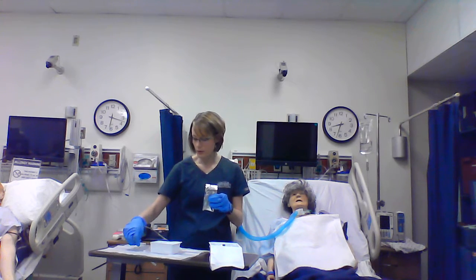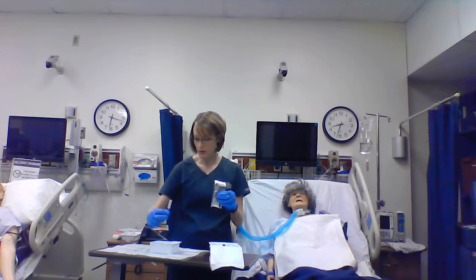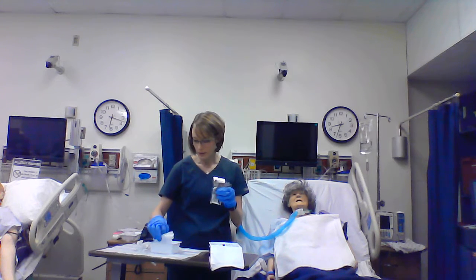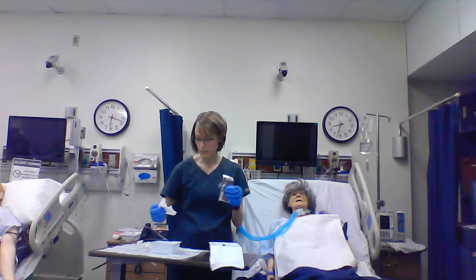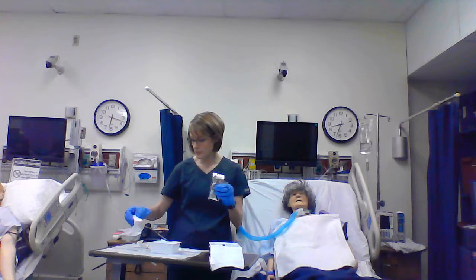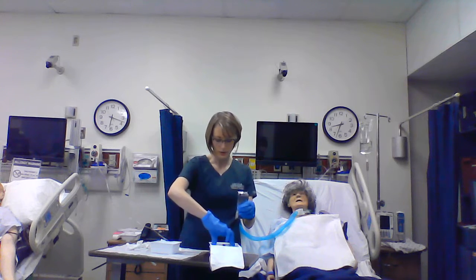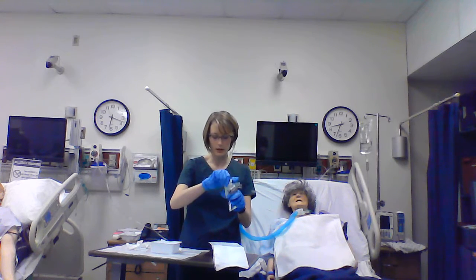I have little pipettes if I need, your trach cleaner, extra trach ties, and then it should have an extra V-sponge as well. So I will set all of these up. And then I also have another set of sterile saline in here.